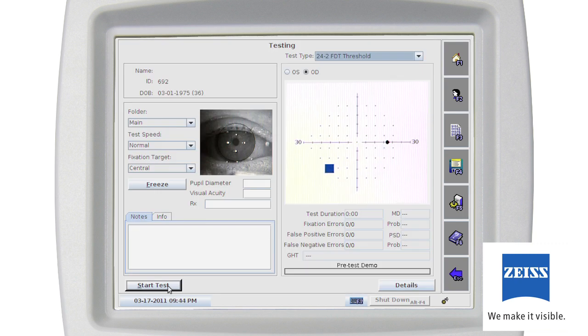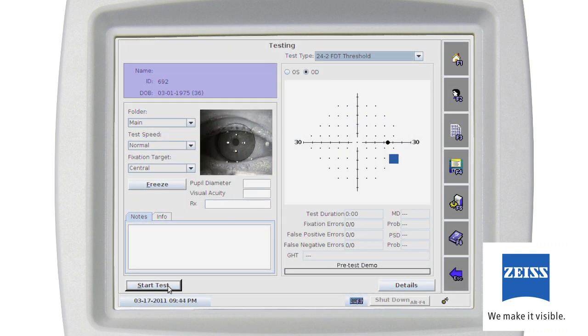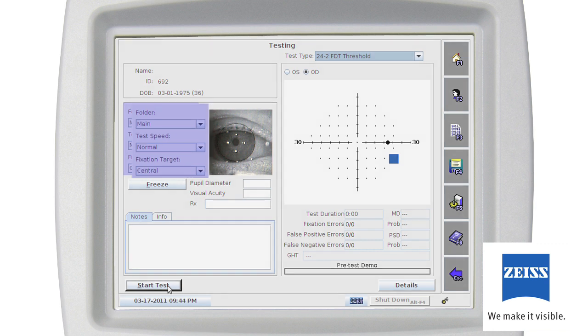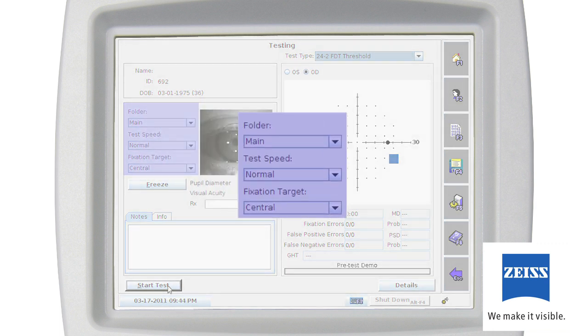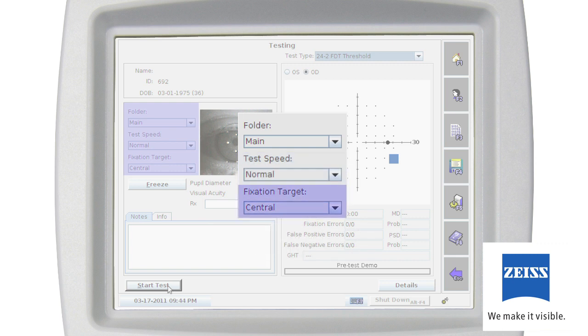You'll now see the testing screen. Until the test is started, stimulus presentations are automatically displayed to demonstrate the test to the patient. The status box in the lower right-hand corner indicates that the pre-test demo is being performed. Confirm the patient's name, ID, and date of birth are correct and that the proper test type is selected. Use the pull-down menu to select a different test type if necessary. Pull-down menus are also available to change the folder that will store the test, change test speed, or change the fixation target.